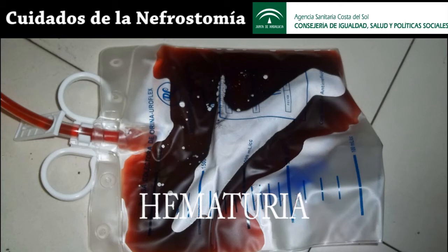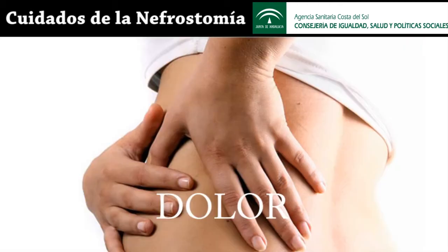Hematuria. This complication is very common. Most bleedings are mild and require no treatment. Severe bleedings settle down on bed rest and are treated with cold saline solution washes. Pain. The patient may suffer some pain or discomfort at the nephrostomy tube entry point. Pain usually settles down in a couple of days with analgesics.